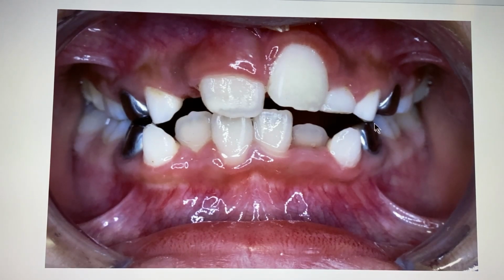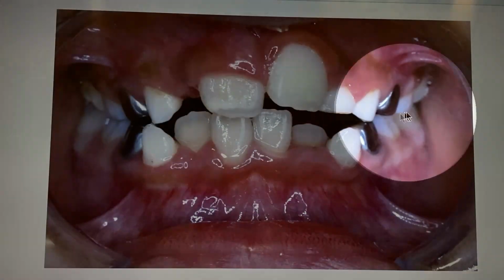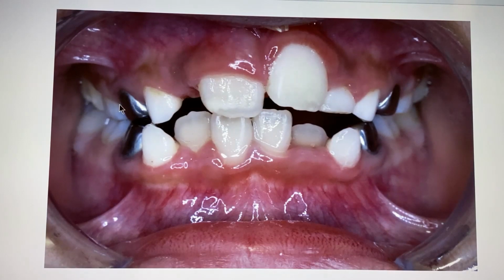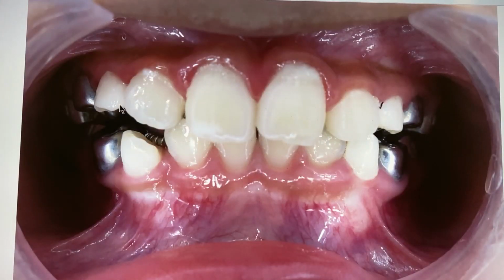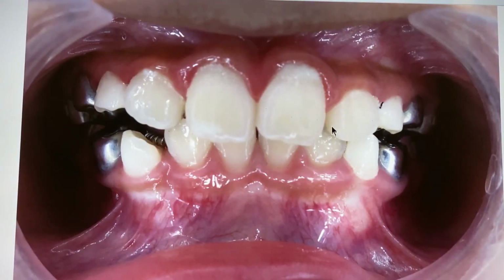Obviously, that sounds quite invasive, and the parents were not very convinced of this treatment approach, and they came to see me. I suggested, since the back teeth are leaning inward, we see if we can use an expander to widen the arch first, and see how well the space can be developed once we expand the arch. And this is what we did. As you can see, after the expansion, those teeth start to come in, and we were able to keep all her teeth at this point without any extraction.